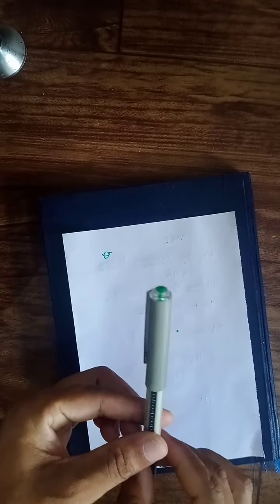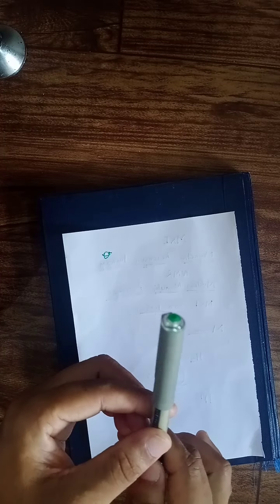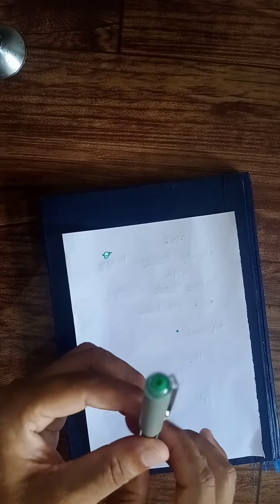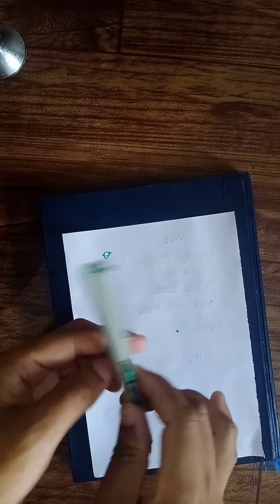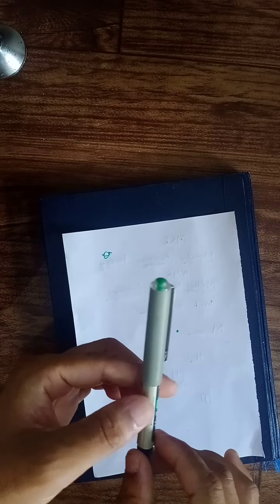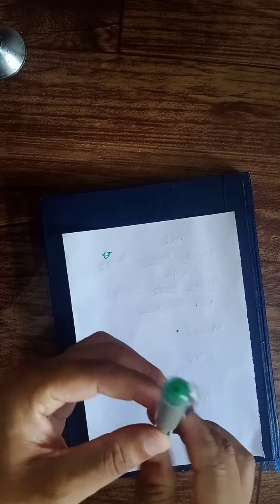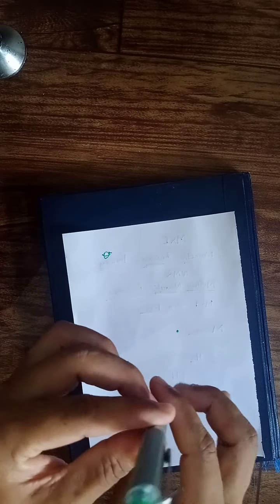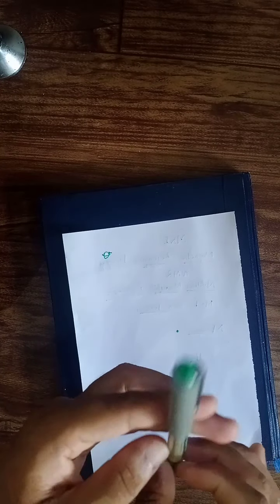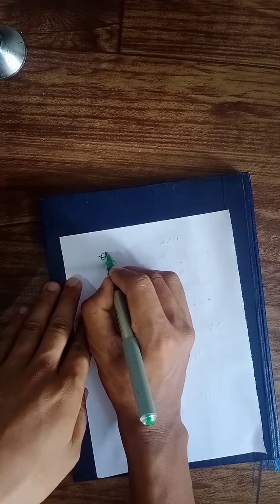It spins as well as precesses. When you think about the universe, the planets rotate as well as revolve around the sun. You can imagine the planets as an example. So here the term spin is the spinning of the proton, and it precesses as well. This is what spin and precession are.